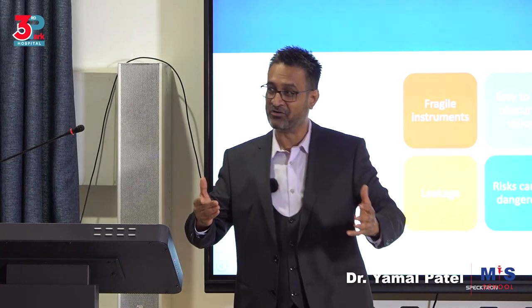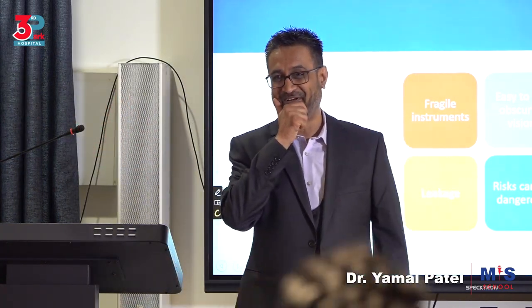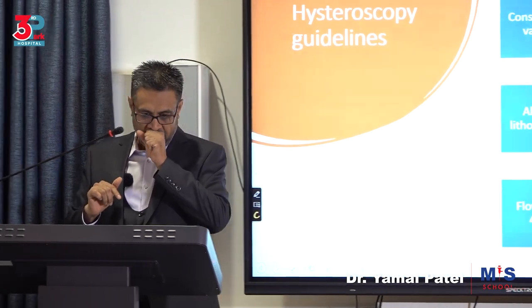In 10 minutes, I kid you not, that table broke one, and I'm like, now what are we to do? So be careful, they're fragile instruments. It's very easy to get an obscured vision because something can come in there. You have risks of leakage, etc. And the risks, I told you, can be very dangerous.